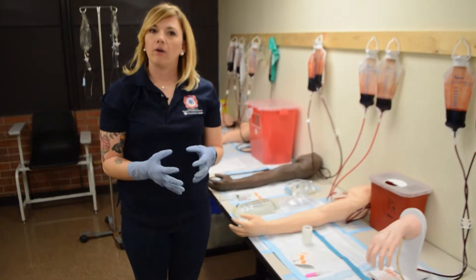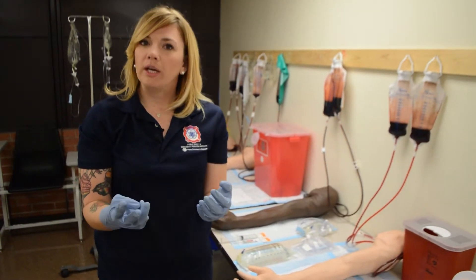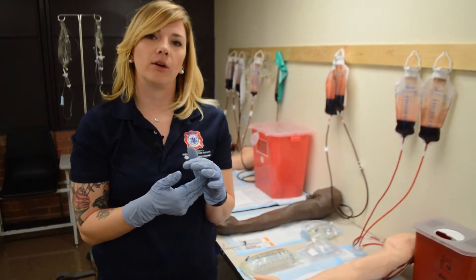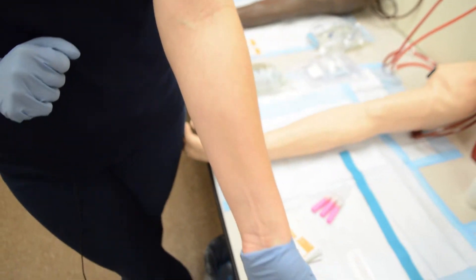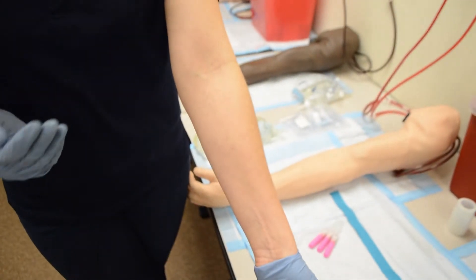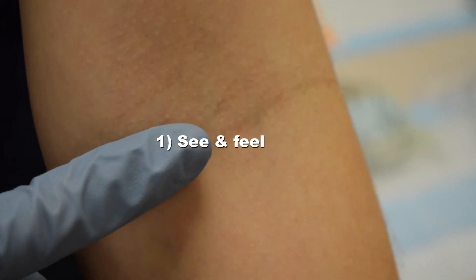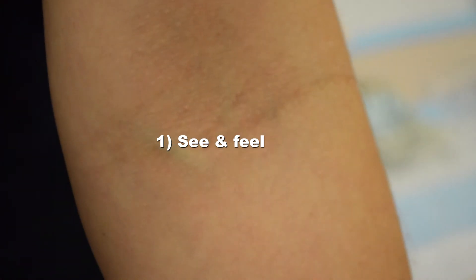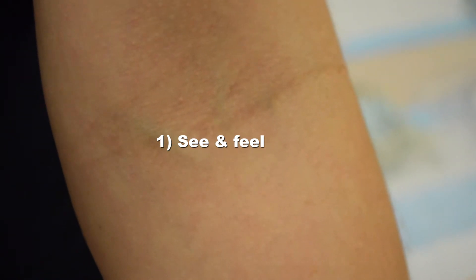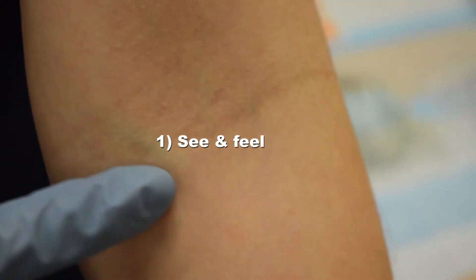So we also want to talk about the ways that you can find and feel a vein. There are three types of veins we're looking for when trying to find an appropriate spot, ranked in order. The first type are ones that we can not only see but we can also feel — and by feel, I mean when you cross over a vein, there is a soft squish or bounce. Try and use your most sensitive finger and use that finger every single time. Our first choice would be one that we can see and feel.